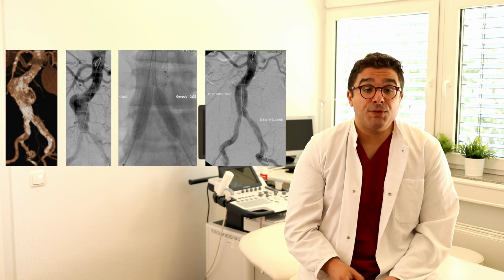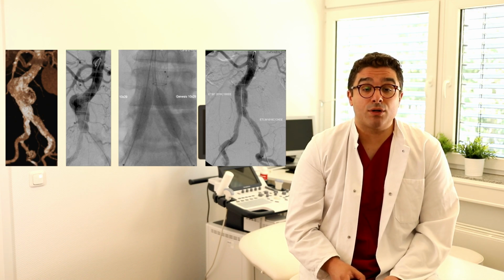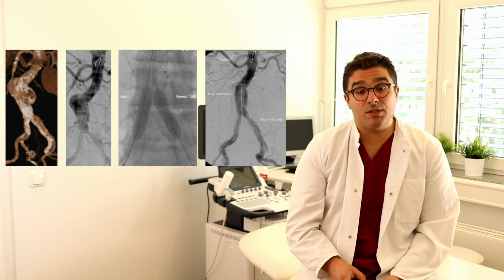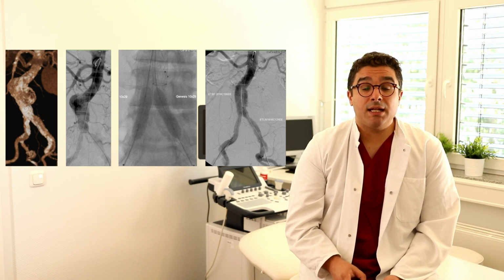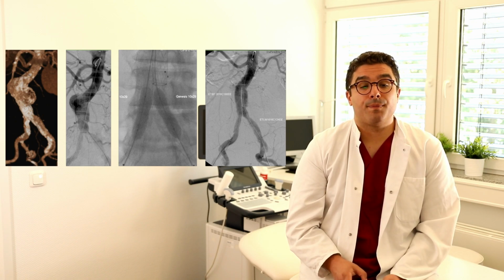In this case, you see the calcification at the distal neck. In the intraoperative angiography, you see the high-grade stenosis on the left side, and then the balloon expanding stents. These were Genesis stent, and finally a nice result that keeps both limbs patent in the long run.